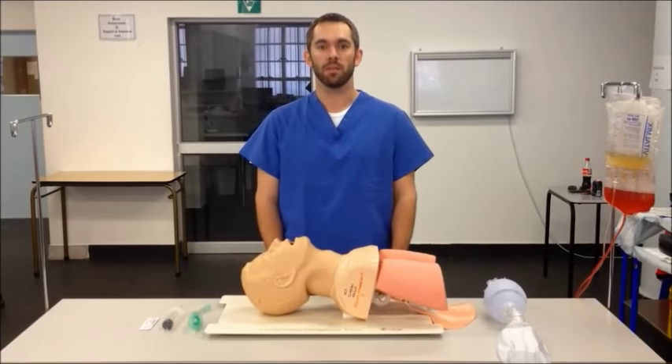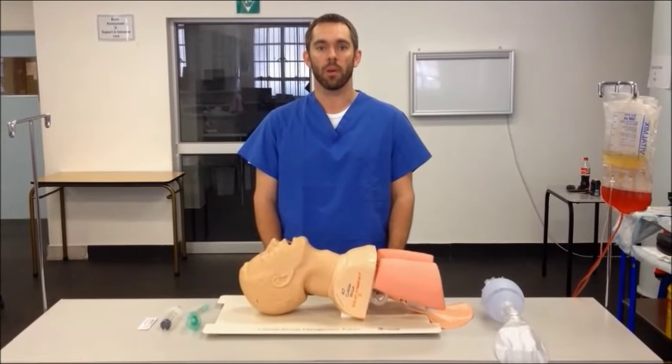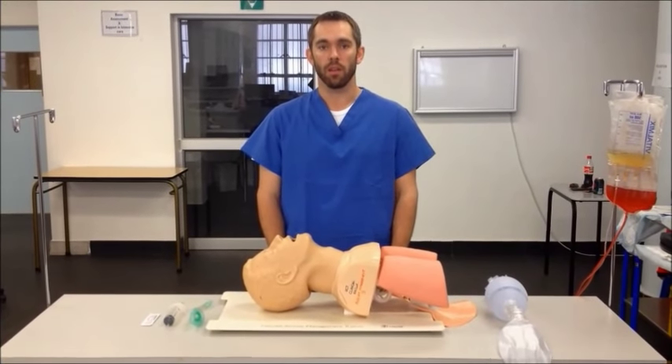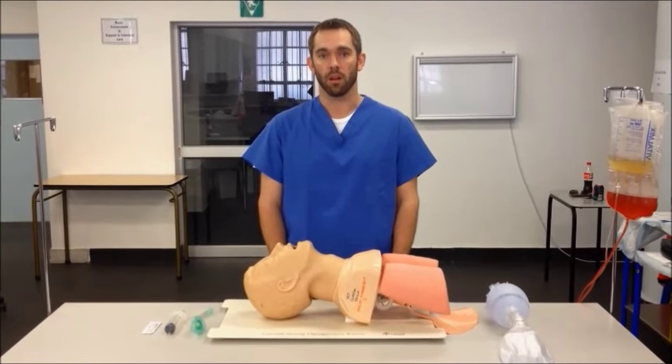Hi, this is Almira Westhazen with Cape Town Emergency Medicine, today talking about correct insertion and use of a laryngeal mask airway, or LMA. An LMA is a supraglottic airway that can be used for the non-definitive management of the airway, or as part of a difficult airway management algorithm.